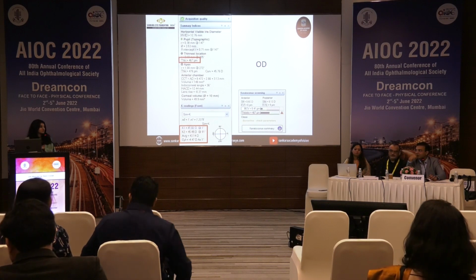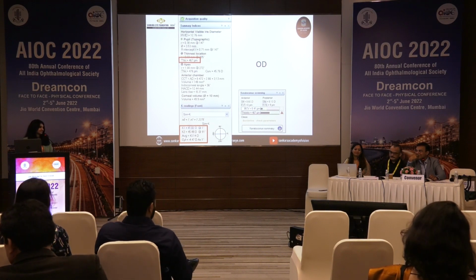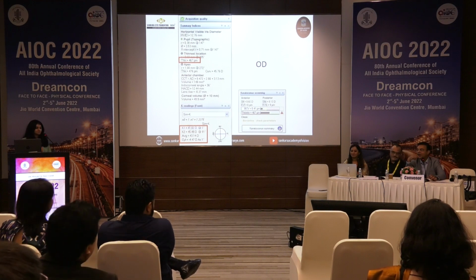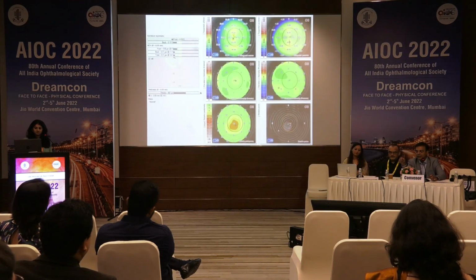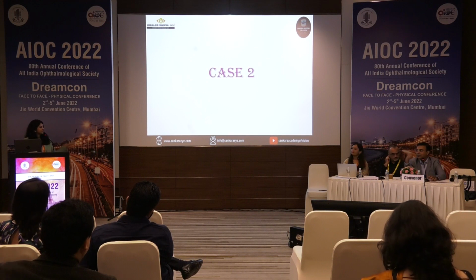But in such thin corneas, wouldn't the parameters not be reliable? Not generally. So a thin cornea by itself is one of the indices which qualifies an eye to be put on watch. So anyway, the first one is clear. Second one, you have those isolated posterior elevation patches. They can be artifactual sometimes.